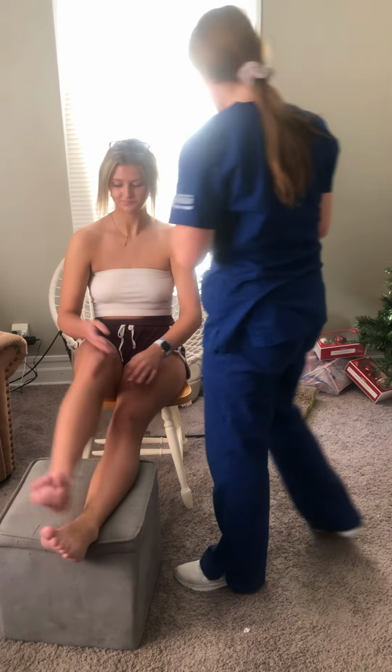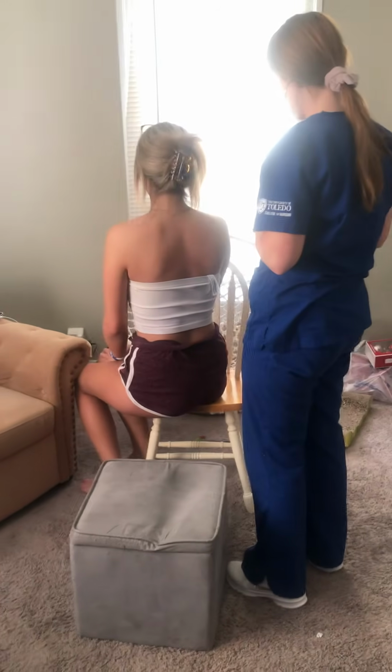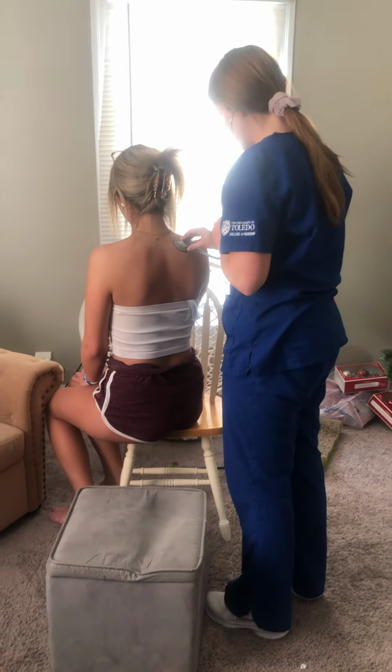All right, can I have you turn around for me now, Morgan? All right, and same thing, I'm gonna have you take a deep breath every time I move my stethoscope. All right, deep breath.